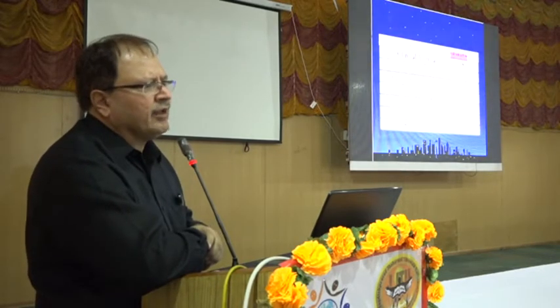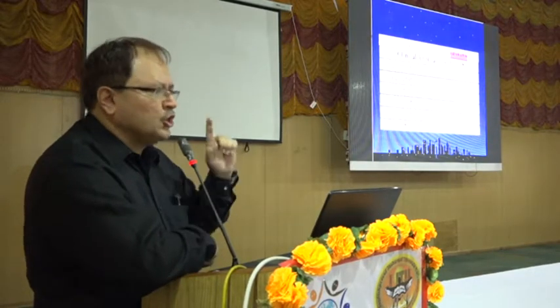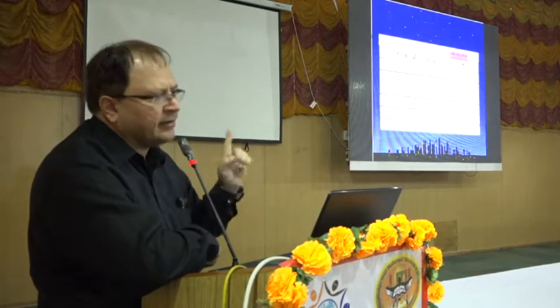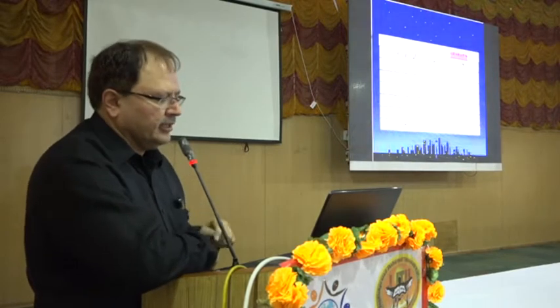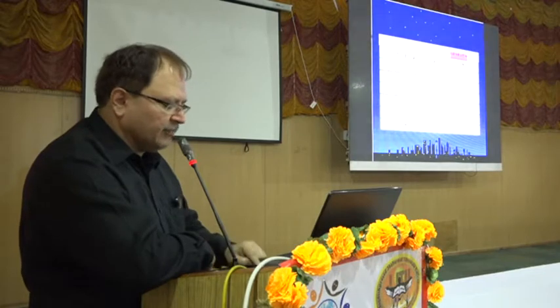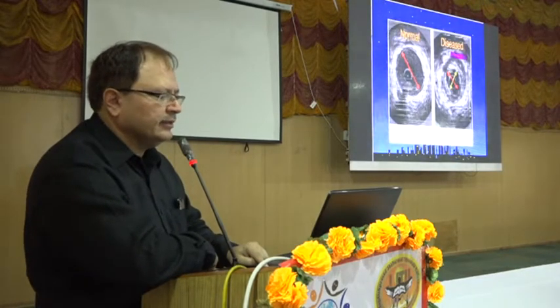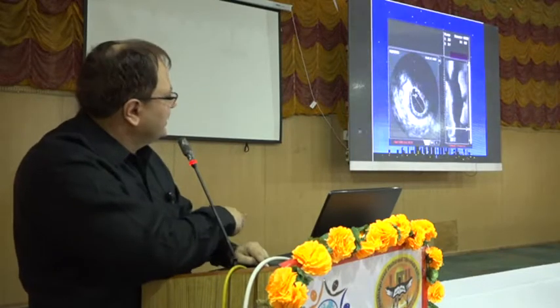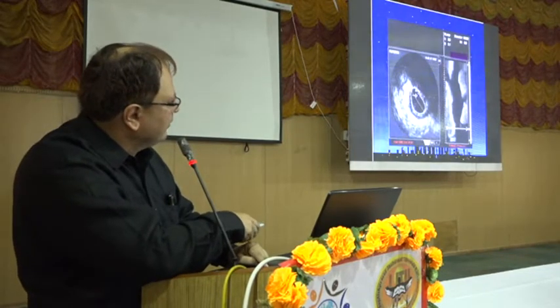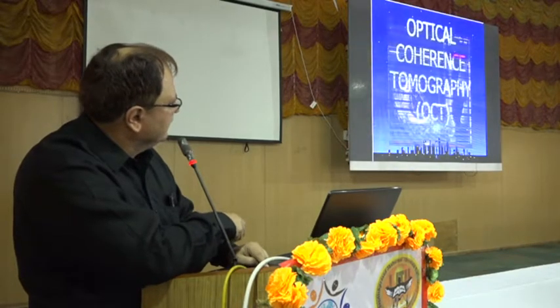We are doing a lot of left main angioplasty. Almost all left main angioplasty should be done under cover of IVUS. And it is very useful in tortuous coronary arteries and stenting of the smaller arteries. You can see various plaque burdens. You can see the irregularities, and you can see the ulcerated lesions also here.